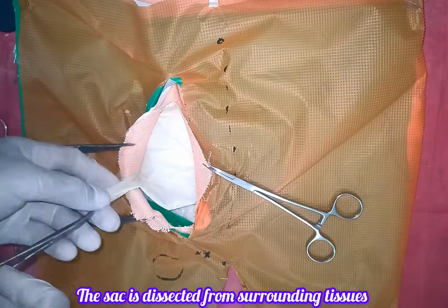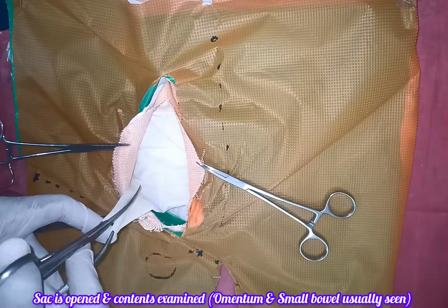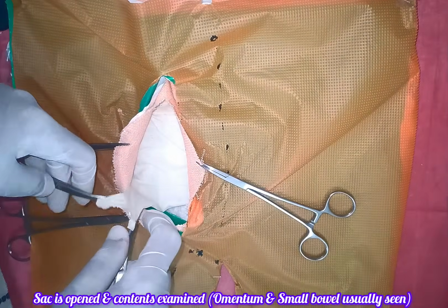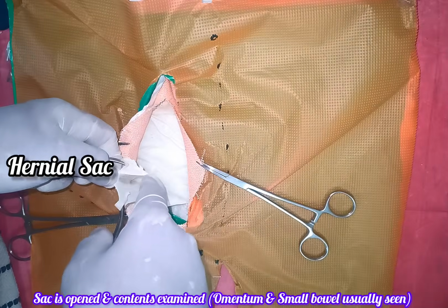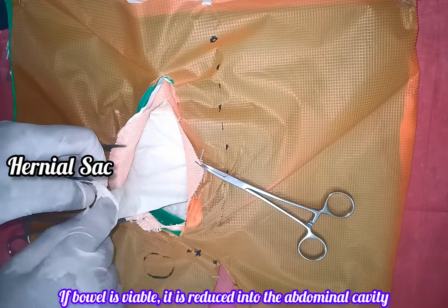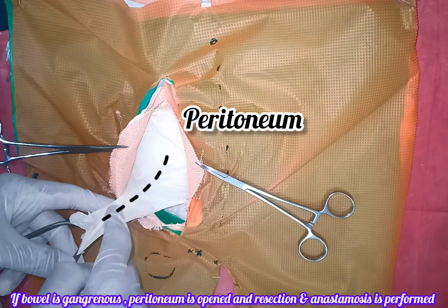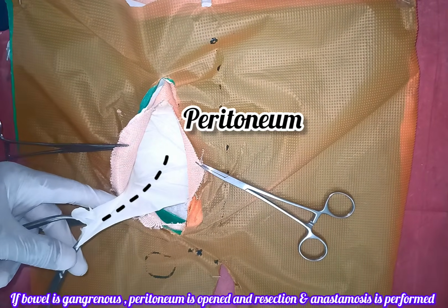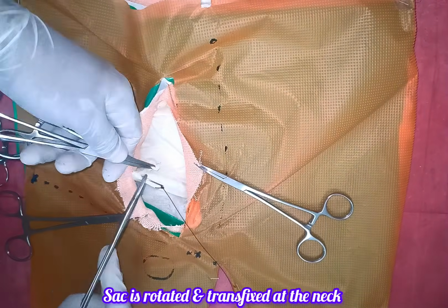The sac is dissected free from surrounding tissues and taken out of the femoral canal. The sac is opened and contents examined. Usually omentum and small bowel are seen as contents. If the contents are viable, they are reduced into the abdominal cavity. If the bowel is gangrenous, the peritoneum is opened and resection and anastomosis is performed. The sac is rotated and transfixed at the neck.